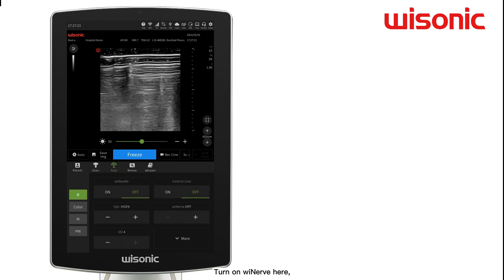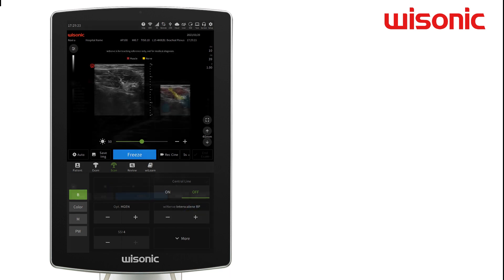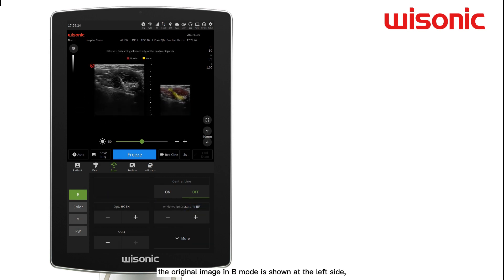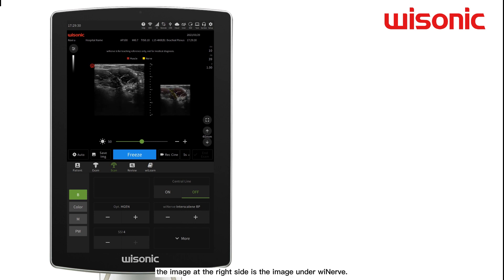Turn on WeNRF here. The original image in B-mode is shown on the left side, and the image on the right side is the image under WeNRF.